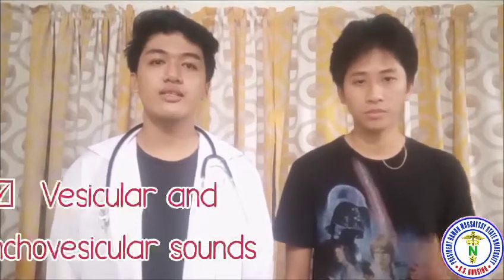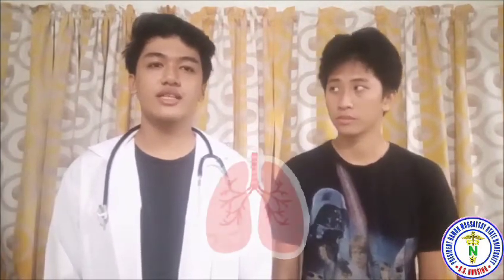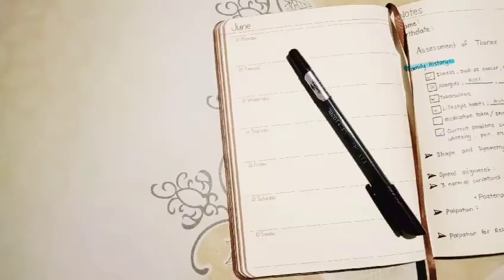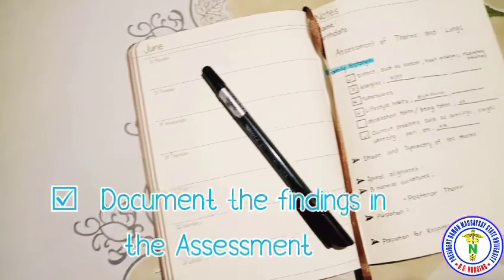The result is that the sound of breathing of the patient is vesicular and bronchovesicular sounds, which are the normal sound of breathing. Any problems detected in this procedure can tell us if there are any injuries or diseases in the lungs of the patient. Document the findings in the assessment of the patient.